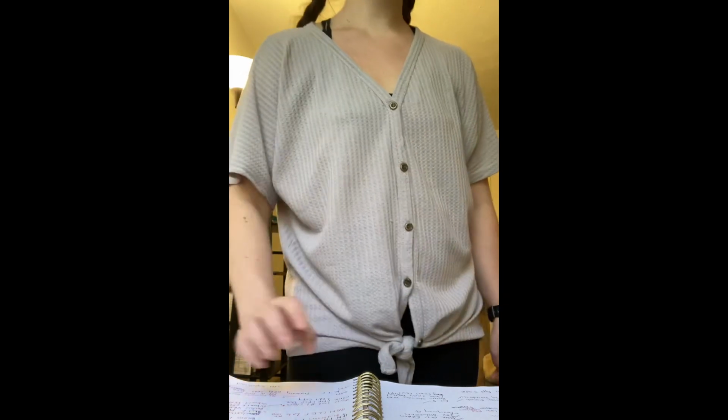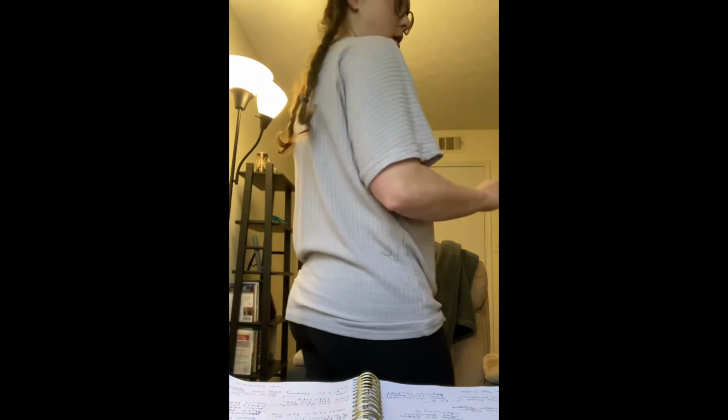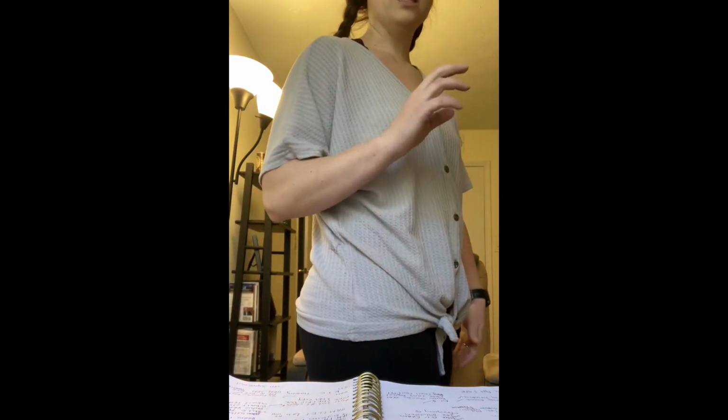But the scapula Y for the shoulder is actually going to be PA with a 60-degree body rotation. They can be standing or sitting, but they're going to be facing the upright detector.